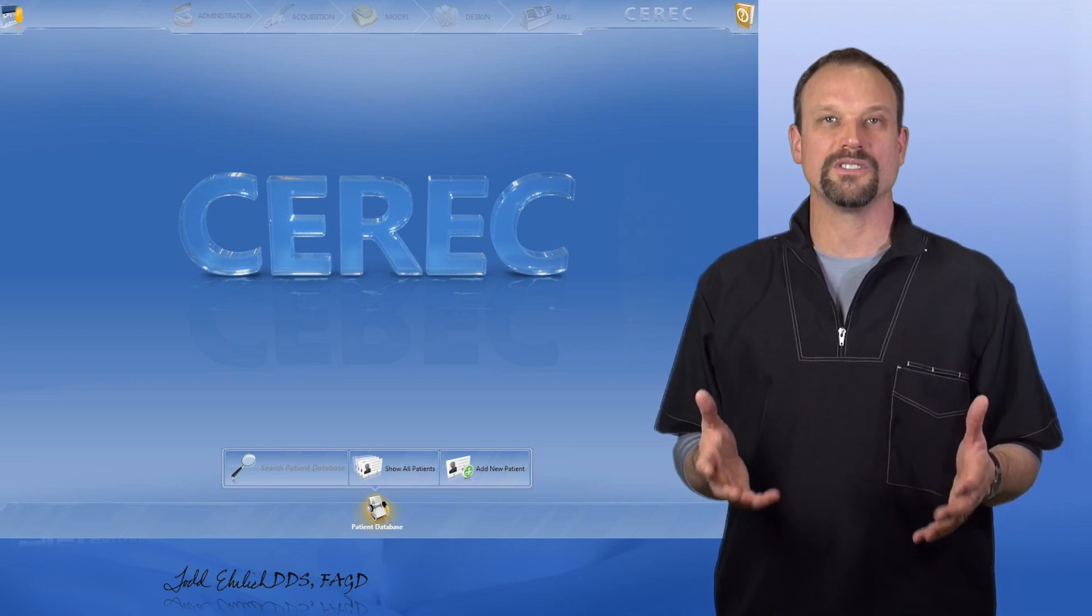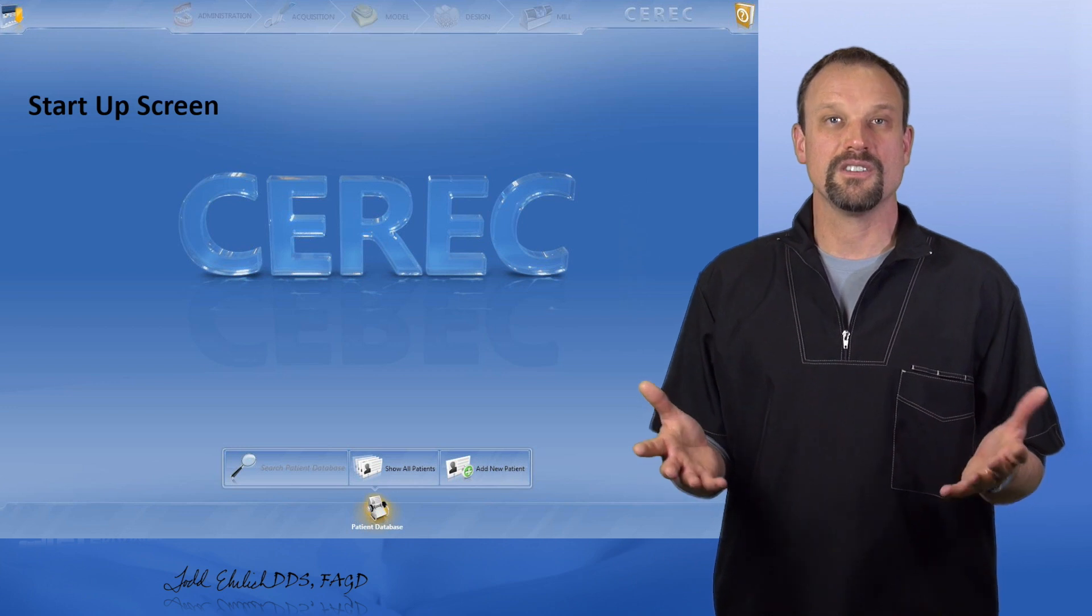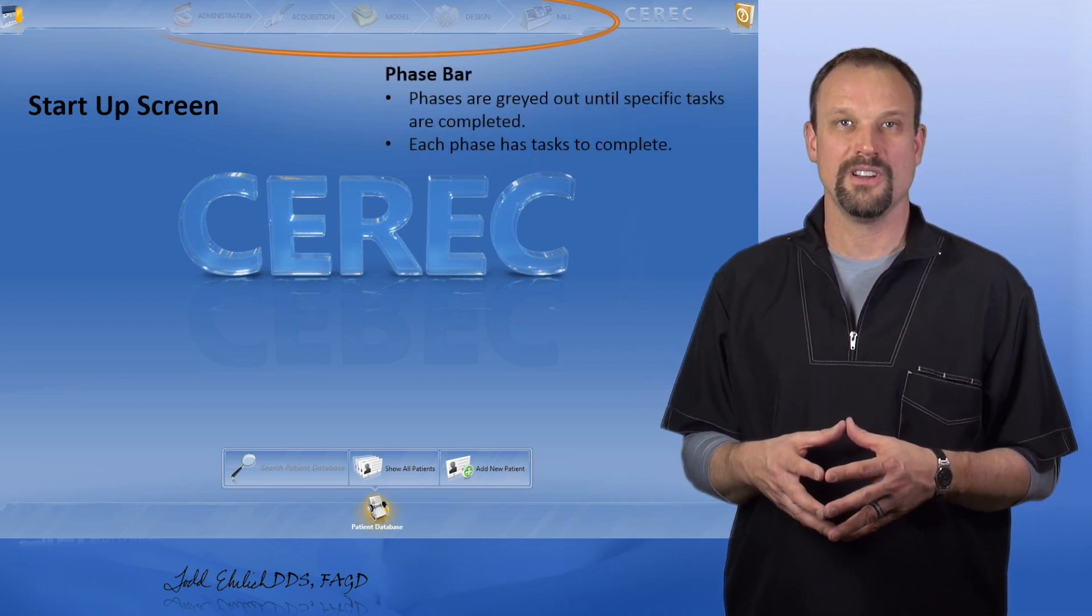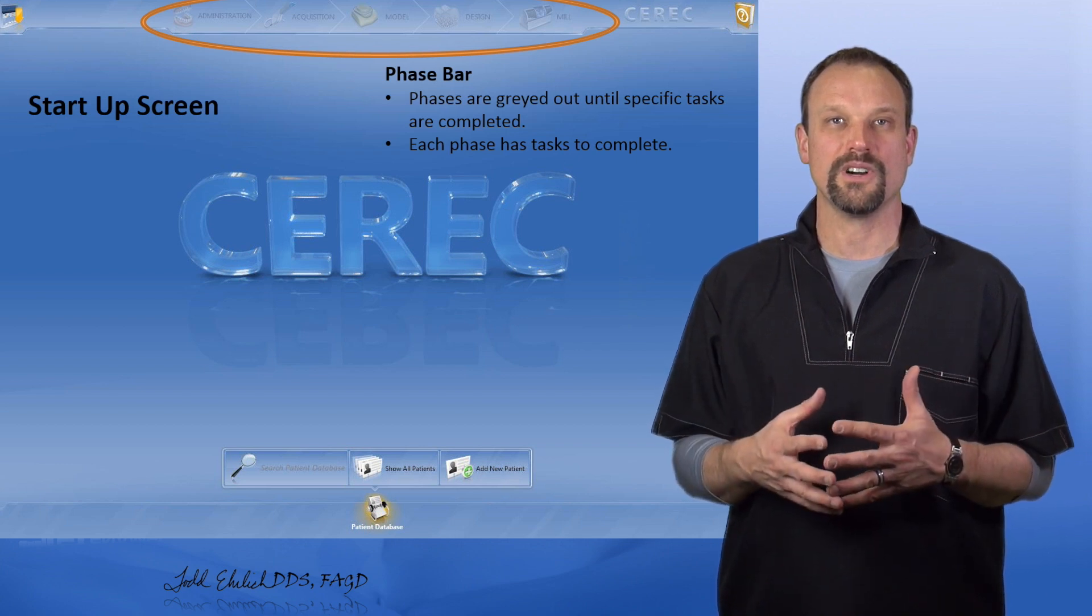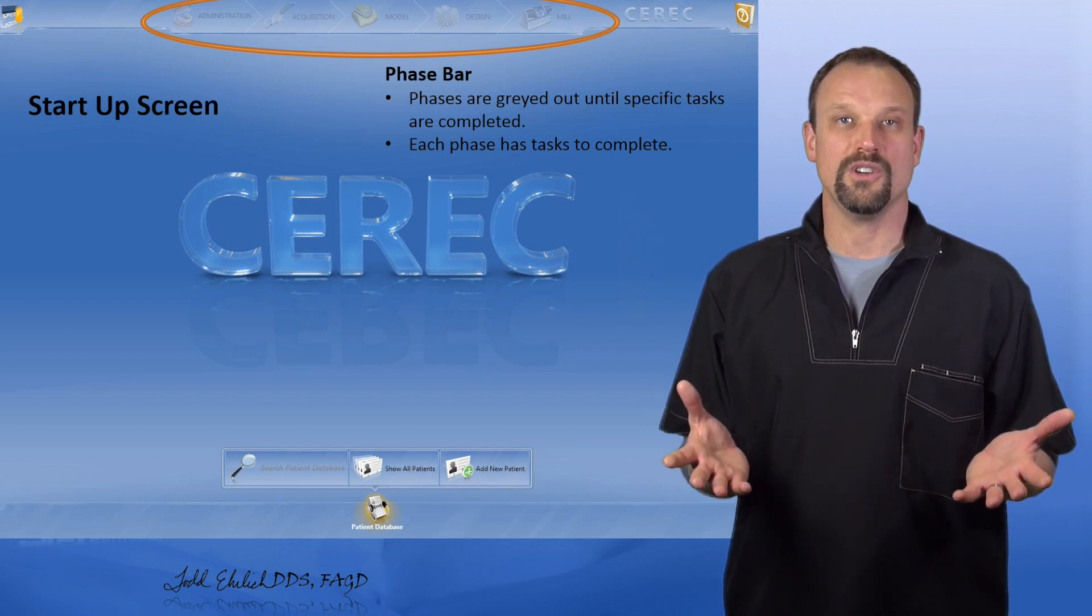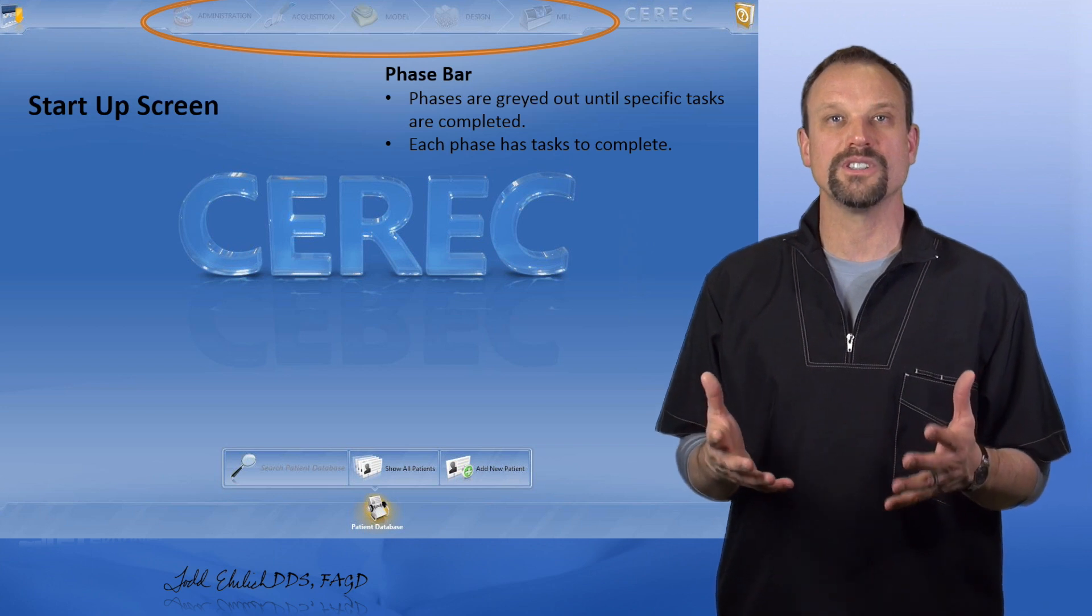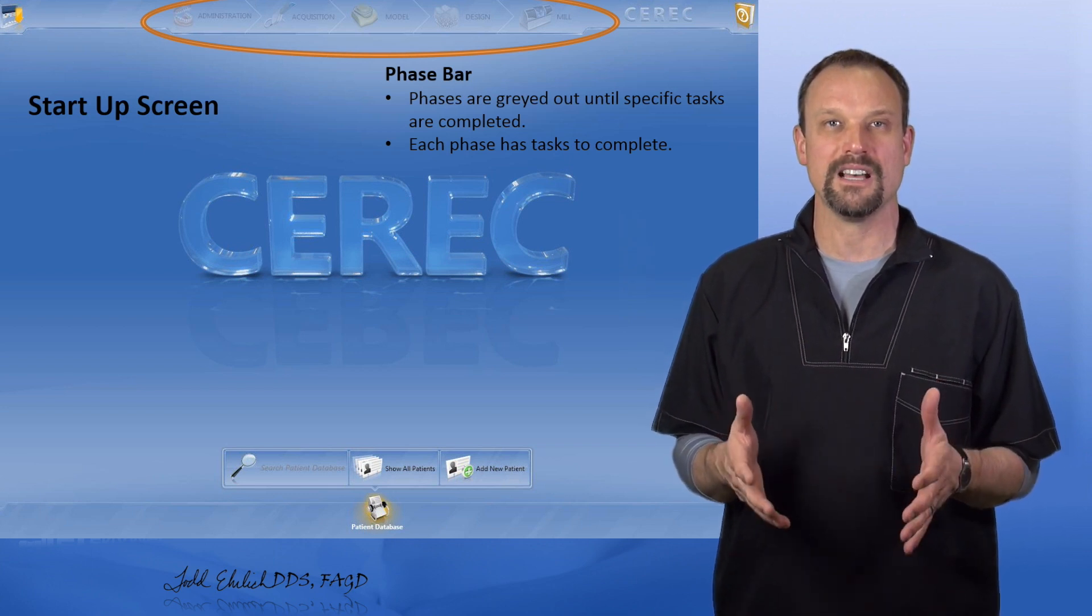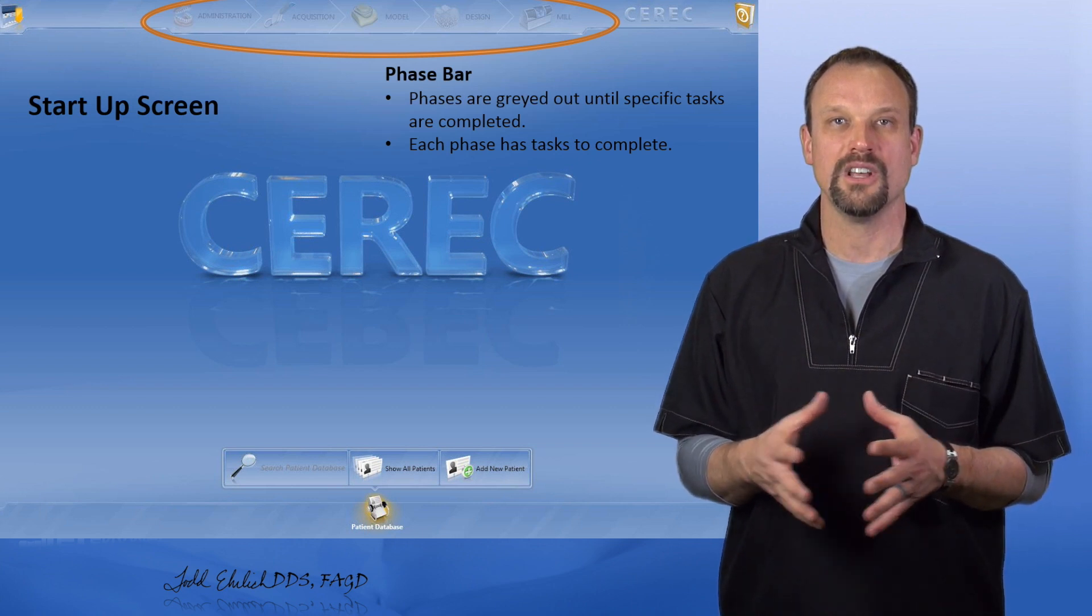When you initially open CEREC, you're just going to see a few things. At the top is what's called the phase bar. These are different phases through the software. There's only one that you can choose from. All the rest of them are grayed out, and the reason why they're grayed out is because we haven't completed the tasks for that one particular phase.